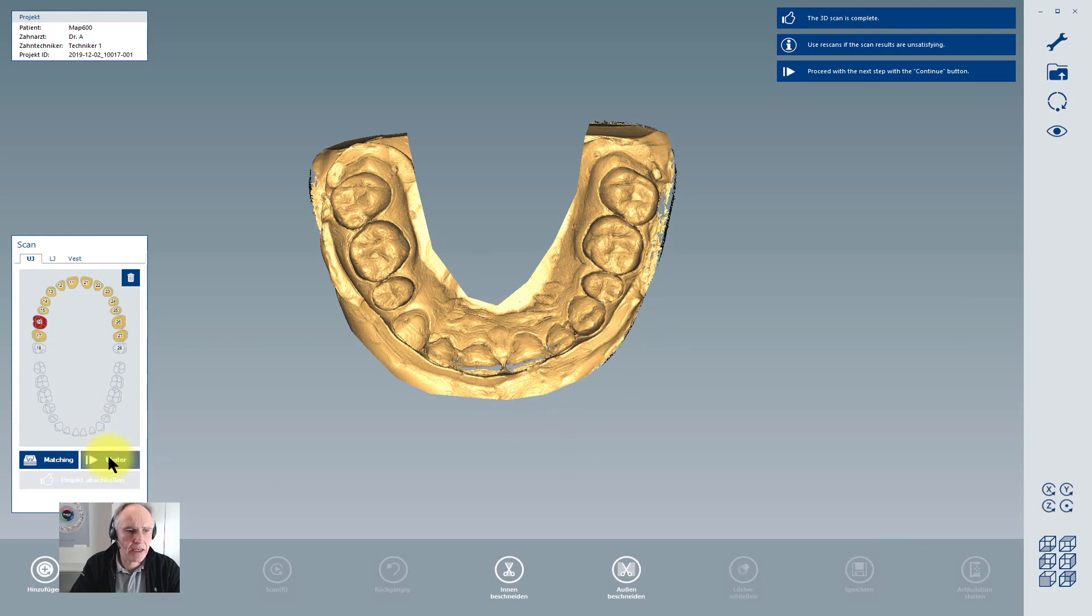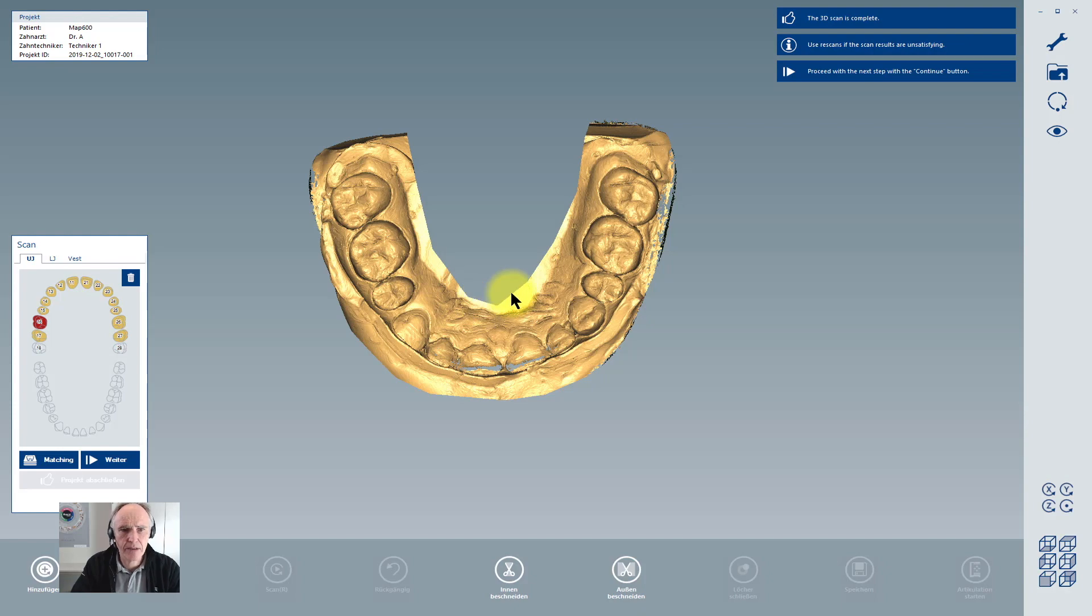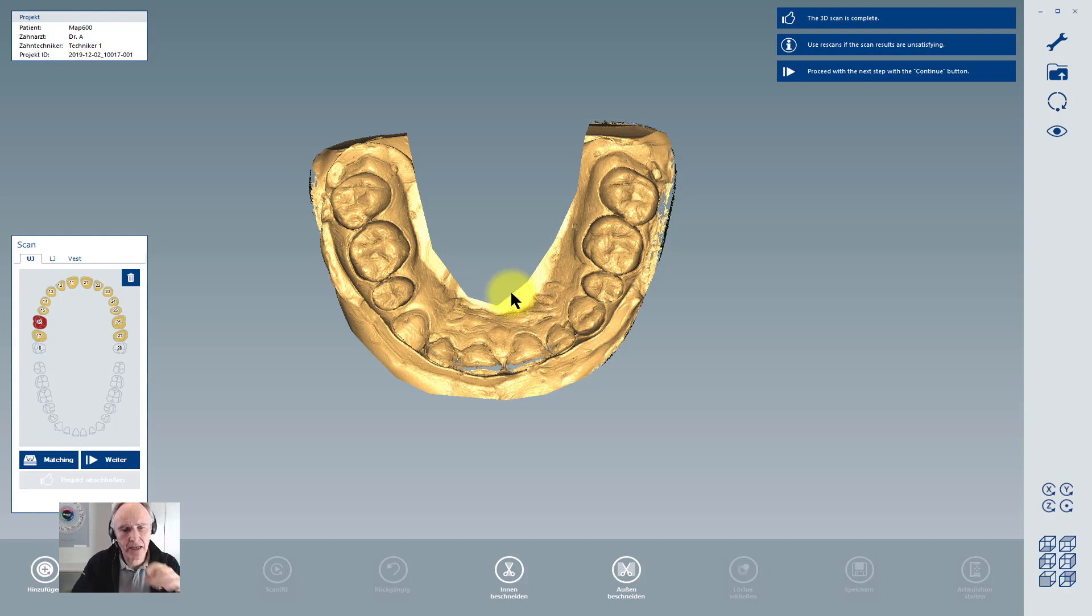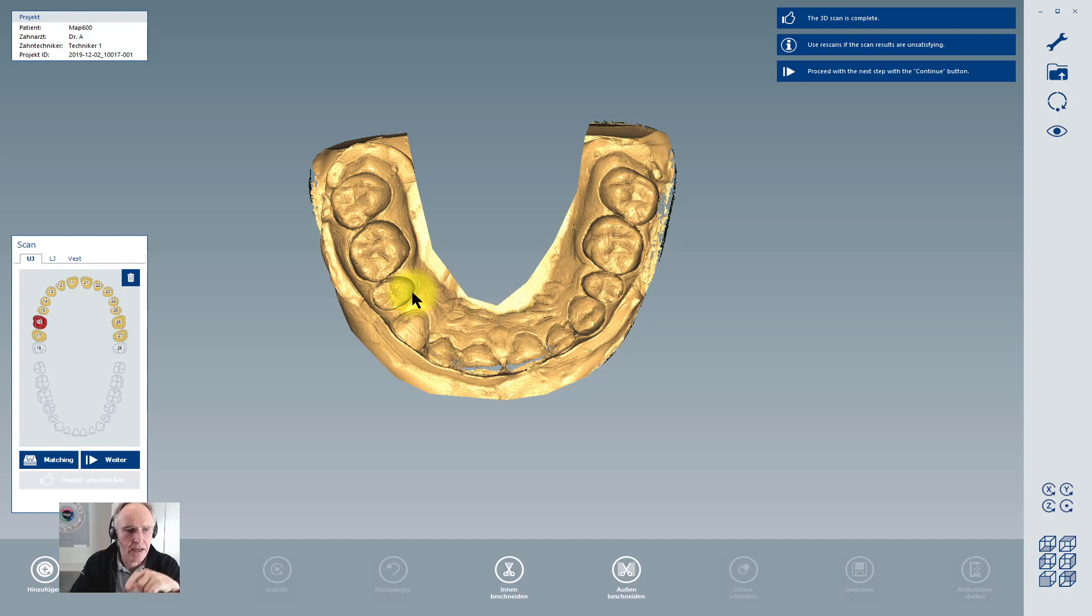Then I can continue. If I have a lower jaw I can continue, and if I want to make a vestibular scan, this would be some impression material on the vestibular side in the patient's mouth. Then I can control the fitting between upper and lower, and then I click on continue next and next.